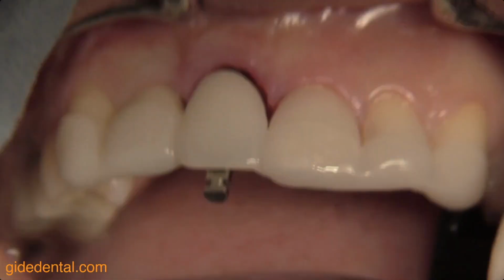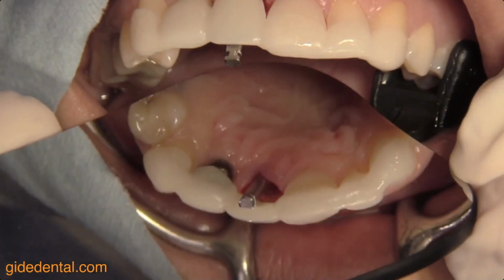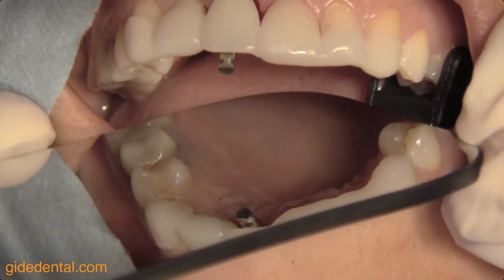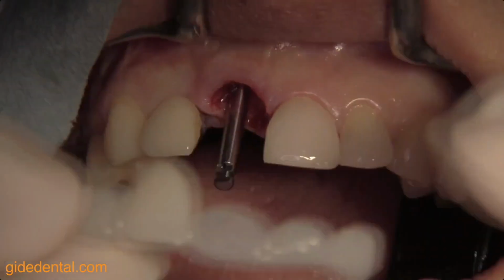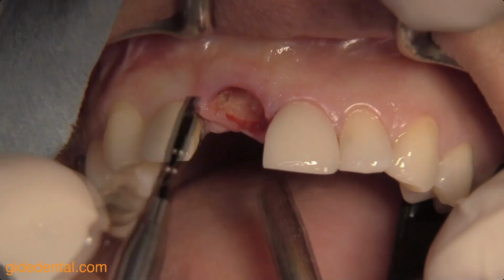And you can see how the drill is coming already through the palate here. You can see that beautifully. So we're maintaining this position and at all times trying to maintain this straight position through the palatal side of the implant. Now we're ready for the second drill.